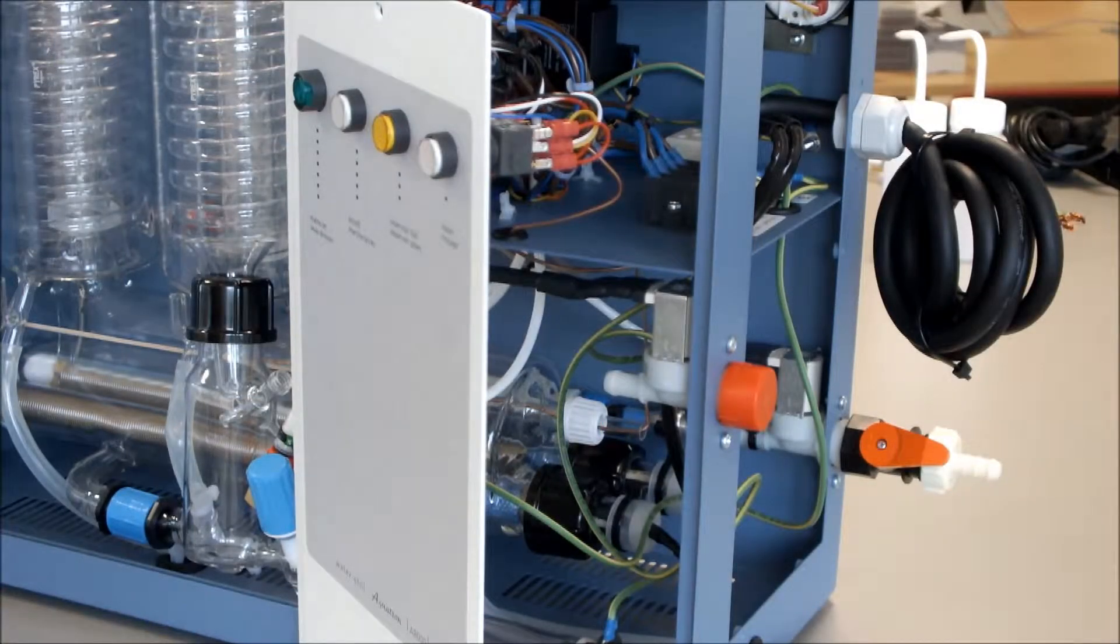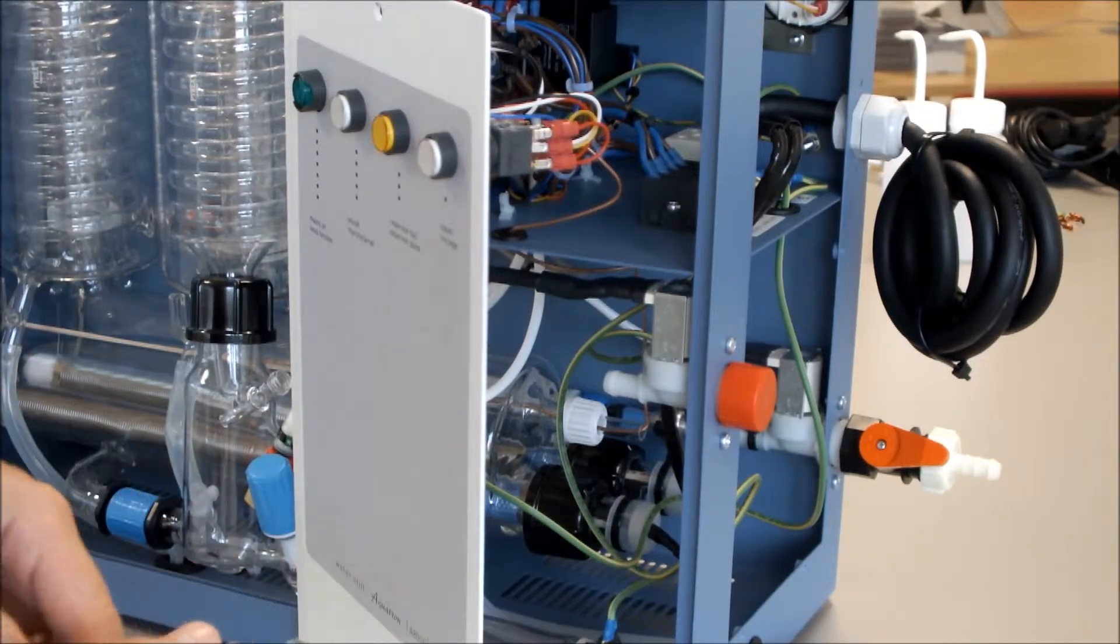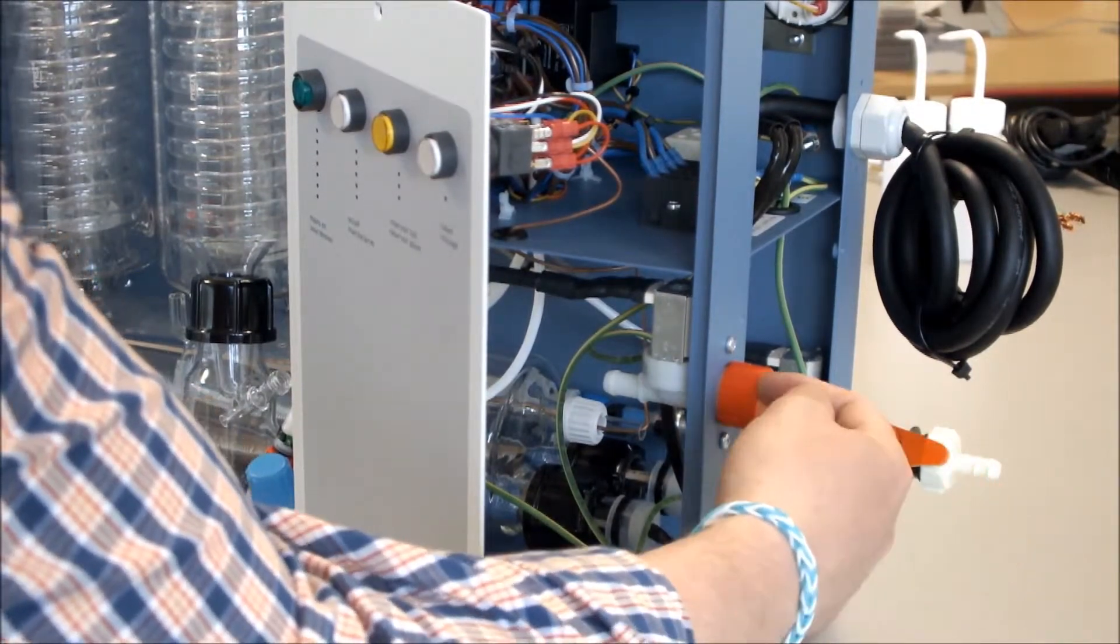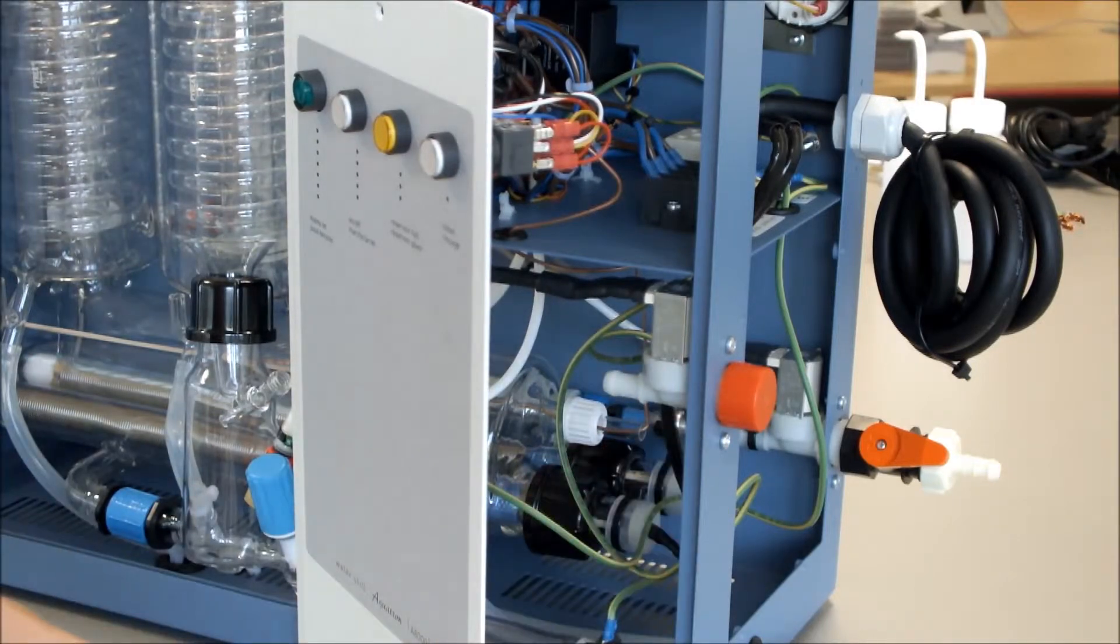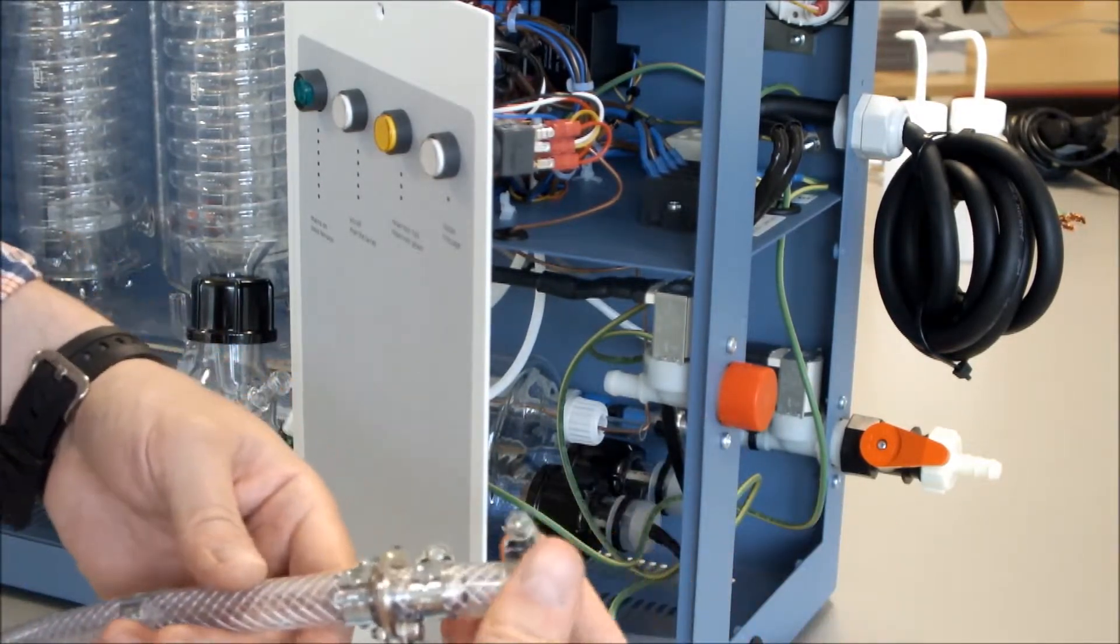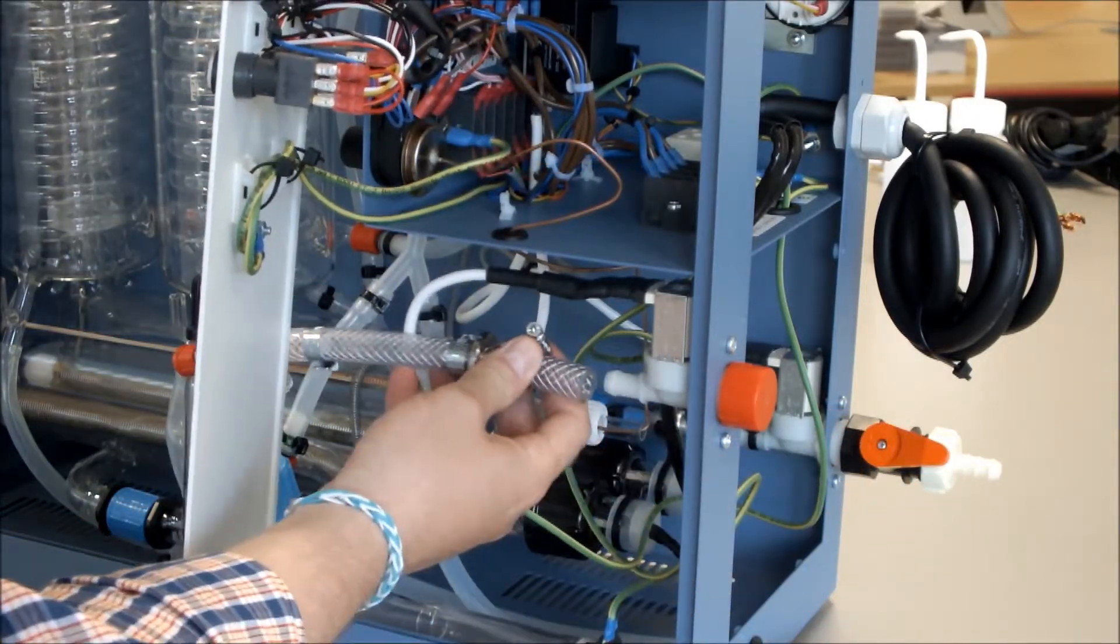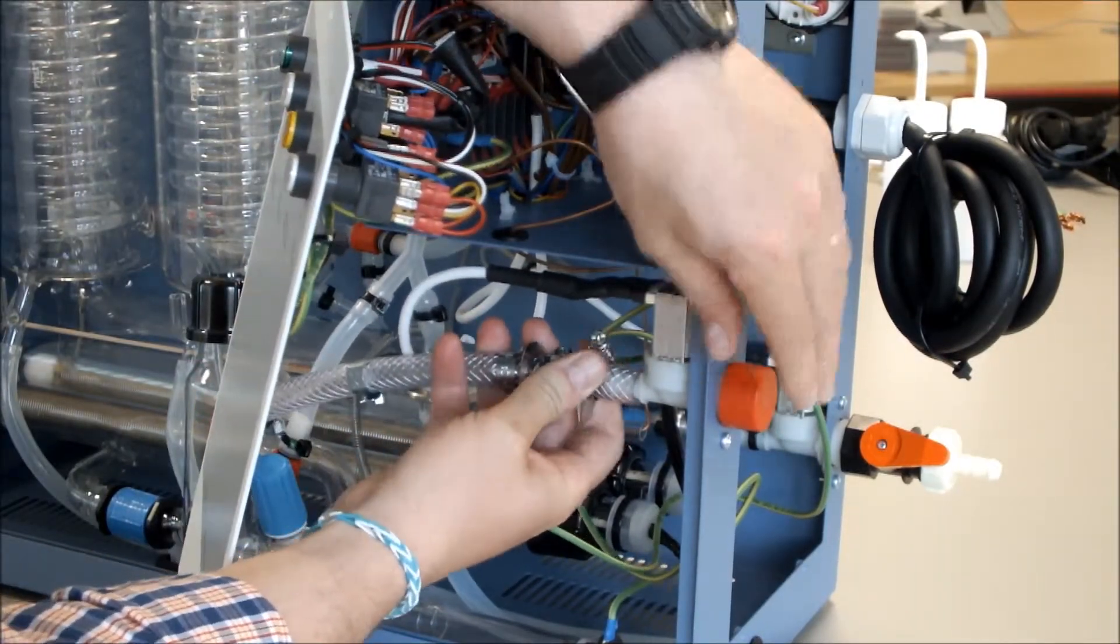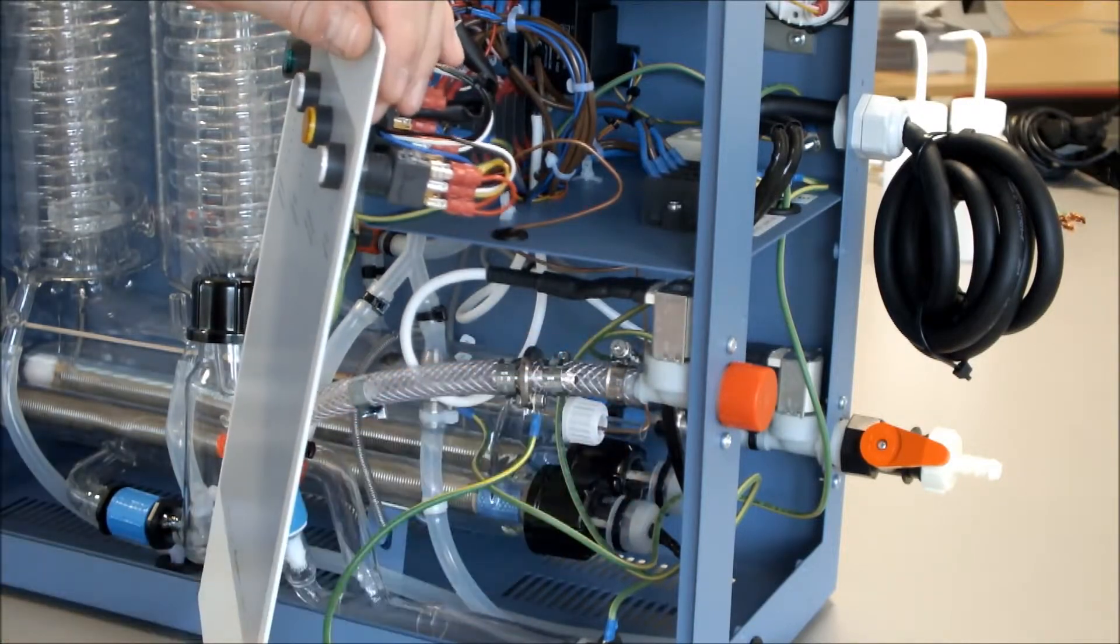The next thing to do is to connect our deioniser pipe assembly to our deionised or pretreated water inlet, and we connect it to the solenoid there. The first thing we need to do is put our jubilee clip onto our pipe. We fit the pipe in there and onto the solenoid. The jubilee clip is then tightened up on there.